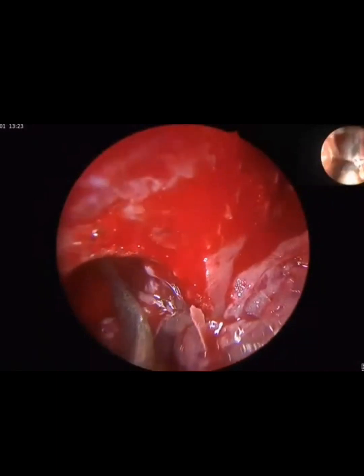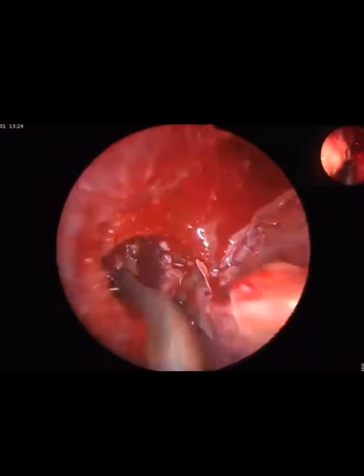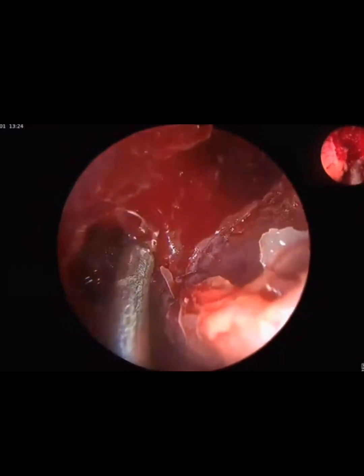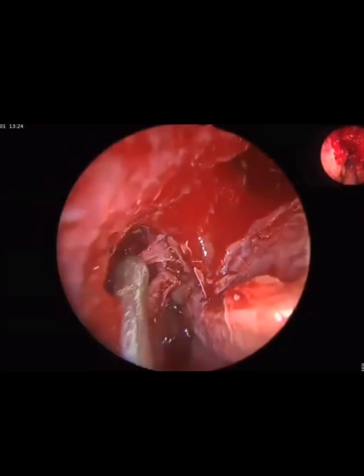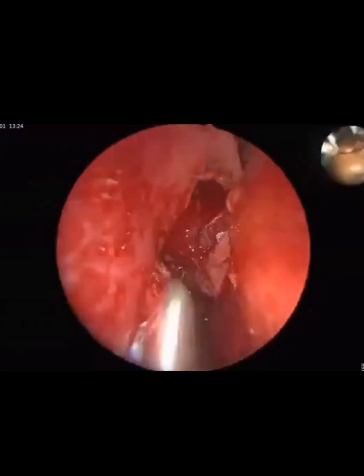See, I am going to clear this first because there is always blood after frontal work. So we have to keep this upper border in mind. So always clear the sinus before starting this work. It's very important for juniors.